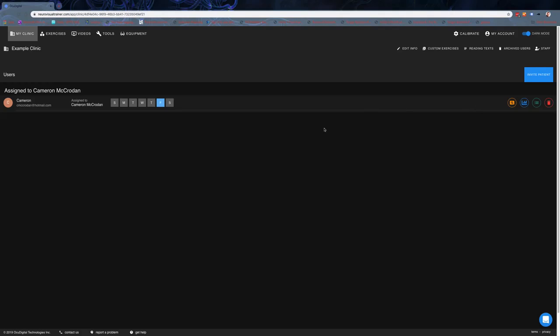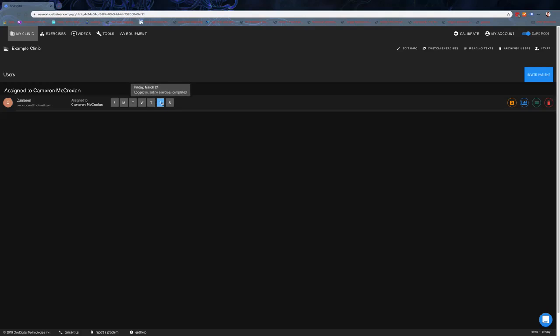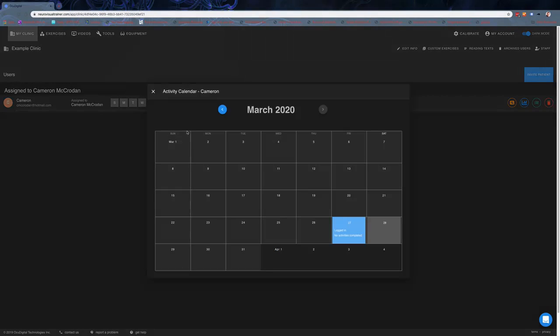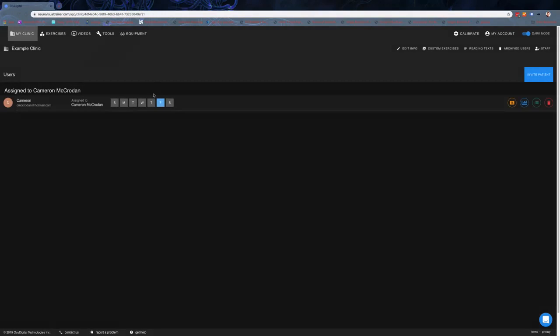You can see right here the patient, their email, who they're assigned to. The days of the week show what days they've actually done their home training and when they haven't. It'll show what exercises and things have been completed, whether they've logged in or not, etc.